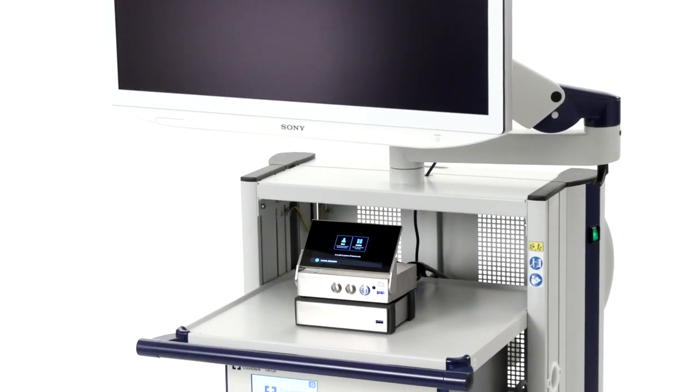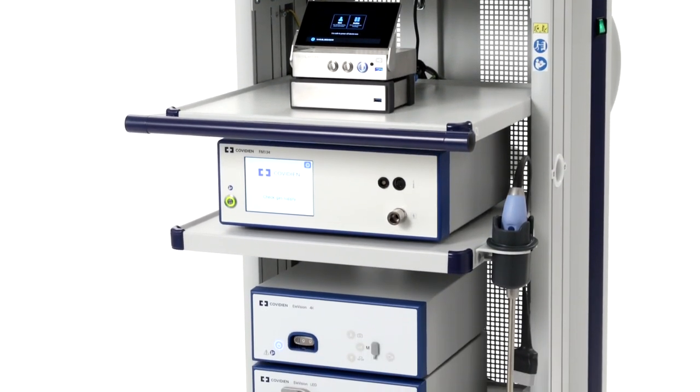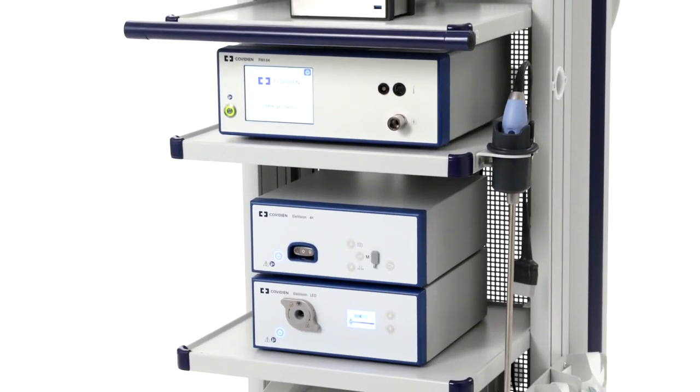Thank you for choosing the Elevision 4K Plus platform for your hospital's visualization needs. For further information on this product, please contact your Medtronic representative or visit Medtronic.com.